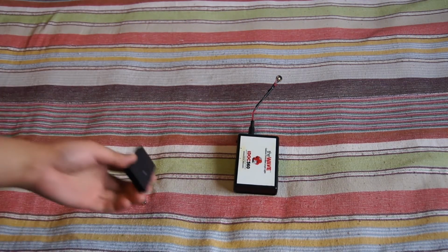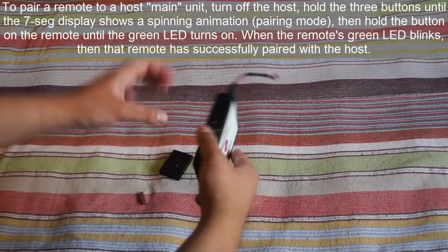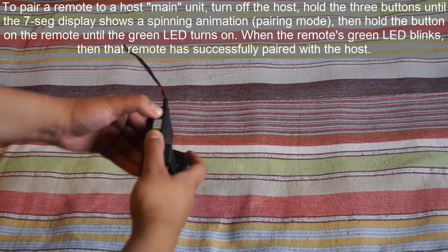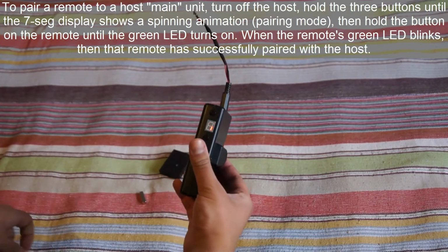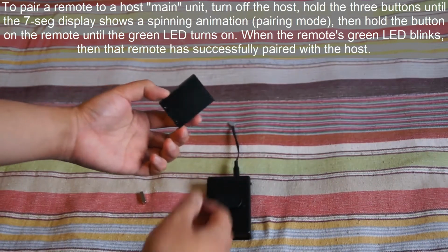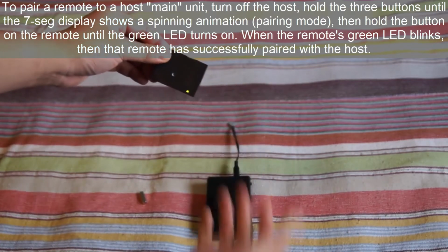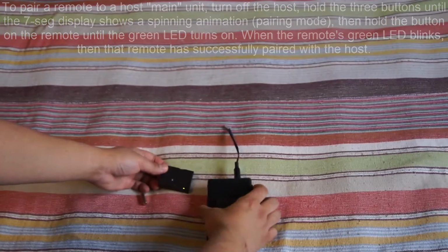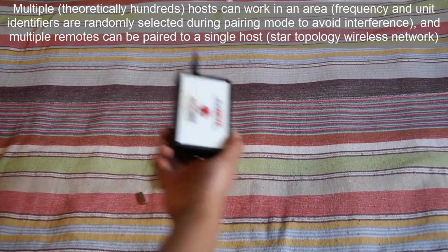Also, since it's wireless, you might know it's like pairing Bluetooth devices to your phone. To do that with this, say you turn it off and press all three buttons until the light starts showing the spinning thing, and on the remote there's a button. You press the button and wait until the light blinks and it's paired. So you can have multiple dentists, each using their own remote, and you can actually have multiple remotes paired to one unit, which is pretty cool.